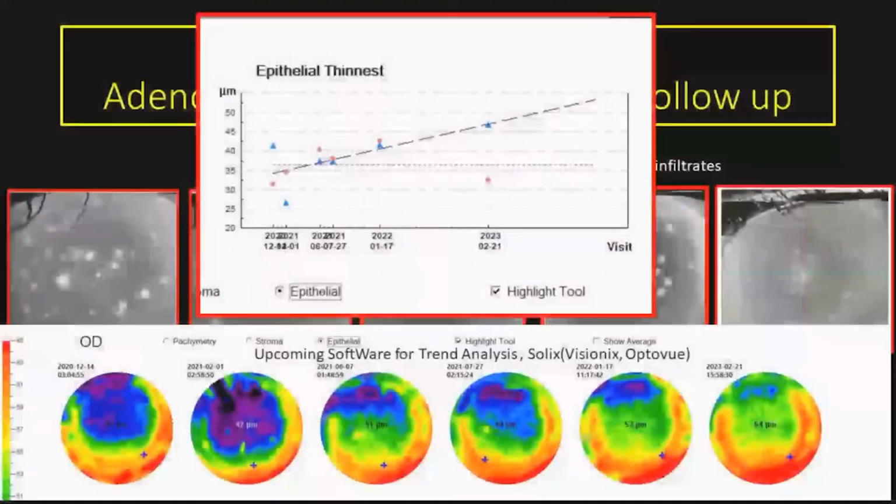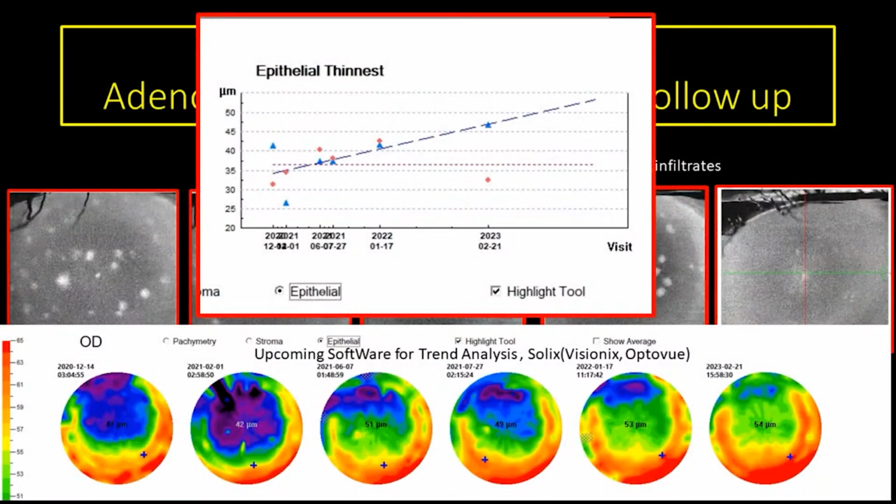And this is the follow-up with the upcoming software and the trend analysis of the epithelium thickness, and you observe the improvement of the thickness of epithelium.